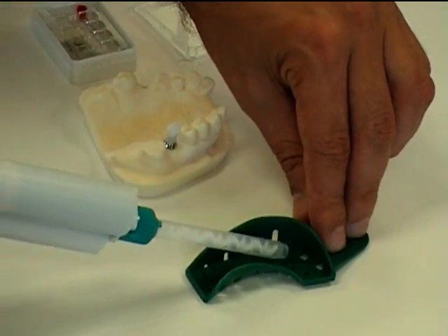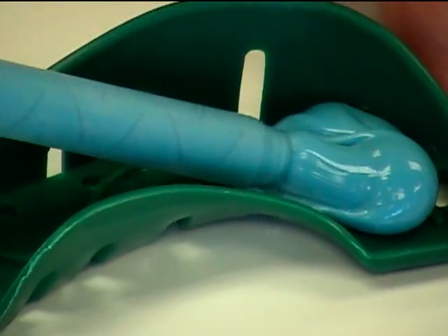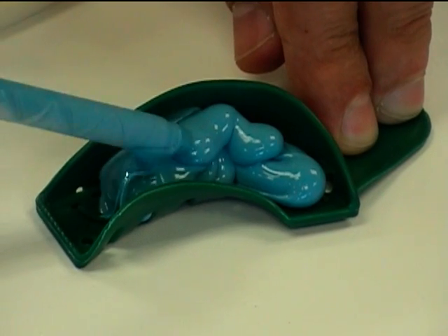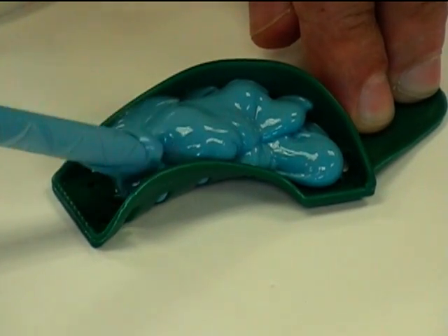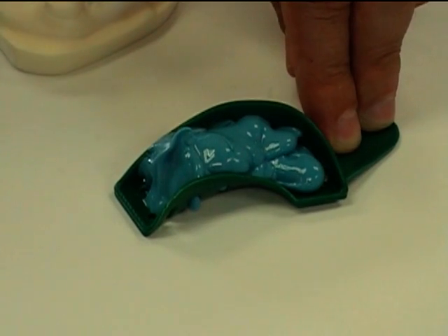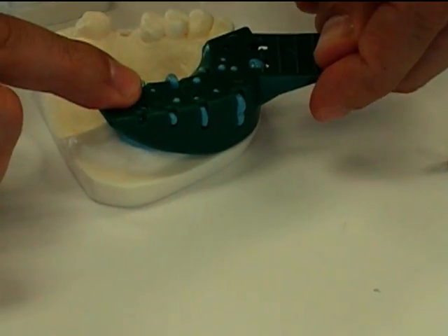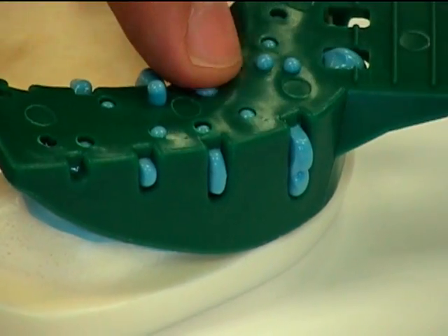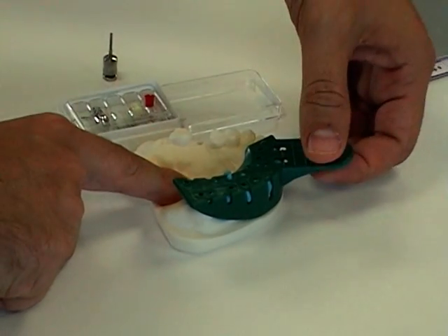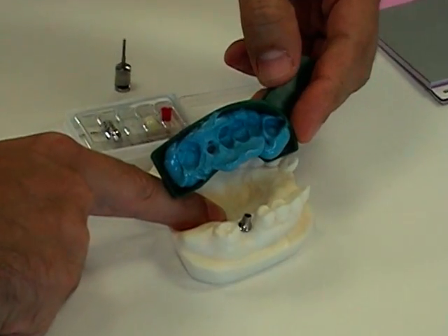We fill the impression tray with the impression material and place it down over the plastic. We wait for it to harden. After waiting for the impression material to harden, we're going to remove the tray, along with the plastic, which you'll notice remains inside the impression material.